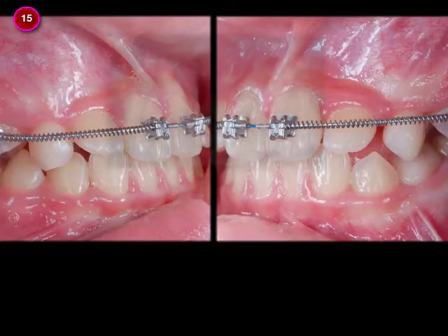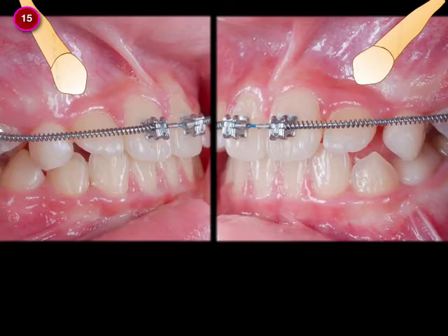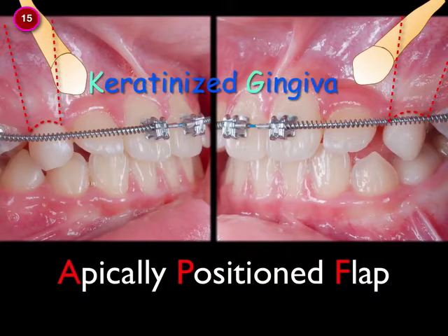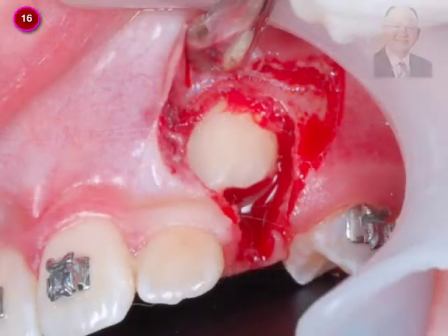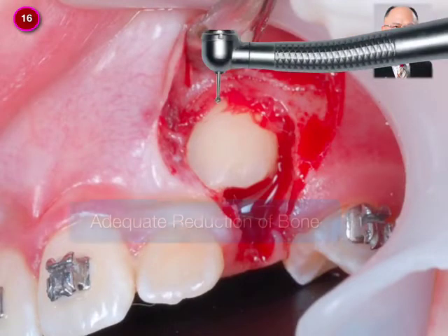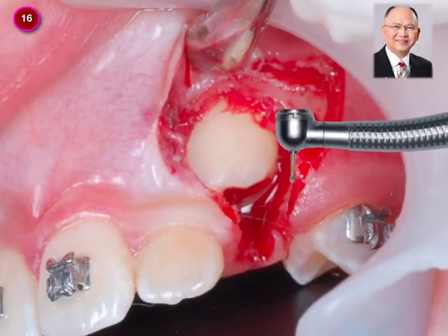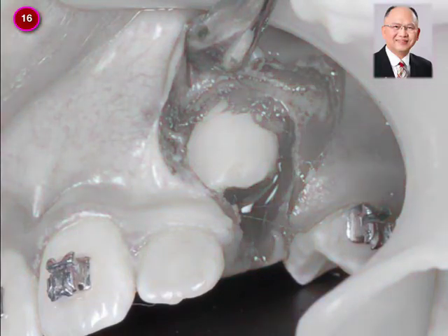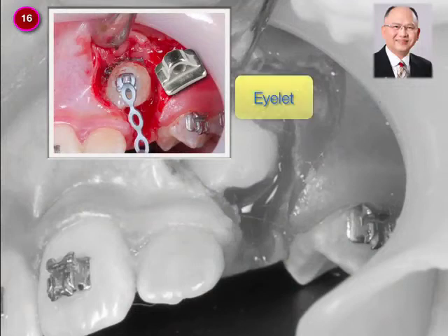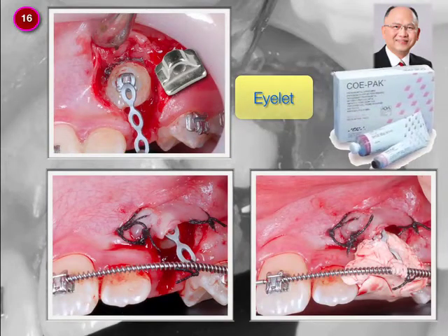We took a cone-beam CT to find the accurate position of the impacted canines, then designed our surgical approach. An apically positioned flap was used to preserve keratinized gingiva around the crowns. The surgery was done by Dr. Chris. After reflecting the flap, we trimmed bone around the crown down to the CEJ, and removed bone along the traction path. Then we bonded the crowns with eyelets and power chain, hooked the power chain to the arch wire, sutured, and finally covered the wound with Coe-Pak.